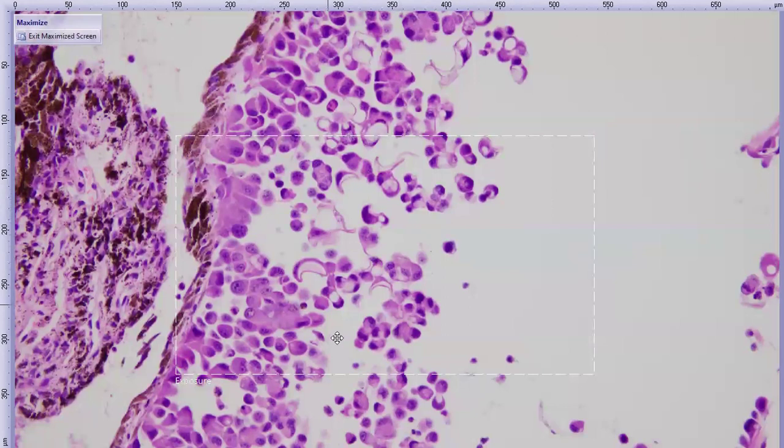And then they're often quite discohesive, and they float off on their own into the intraocular chambers and round up. And quite a few of these cells have large clear vacuoles in the cytoplasm that displace the cytoplasm and the nucleus to the periphery, which some may refer to as a signet ring morphology. If you picture a ring with a big gemstone on top, which would be the nucleus, and the band, which would be this peripheral ring of cytoplasm pushed off to the side. That's why people will sometimes use that term.